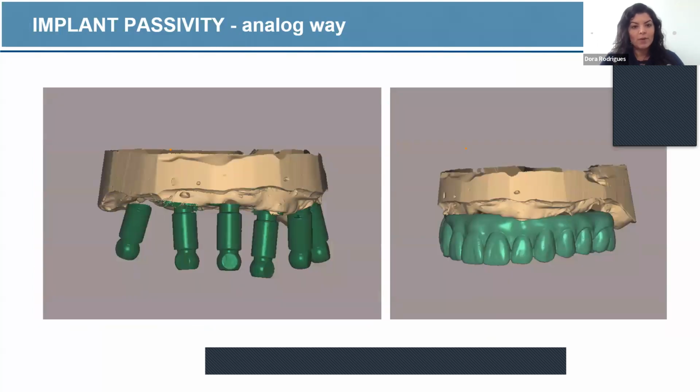So once you're done with that, you pour your model, you use DES scan bodies. Those are universal, right? Everyone has them. They're the ones that are super easy to use. I use them all the time, or with old cases, now that I use the digital workflow, so I don't need this much anymore. But you place your scan bodies from DES on your model, you digitalize them, and then you design your wax-up and you go from there.